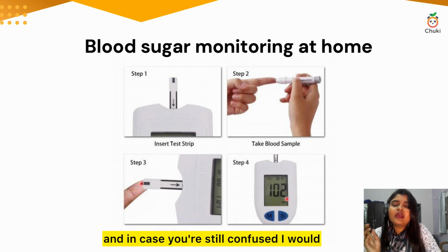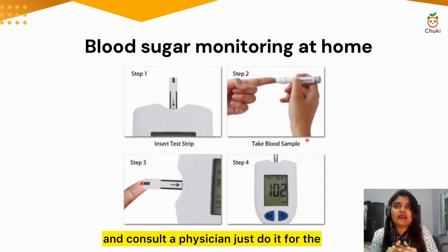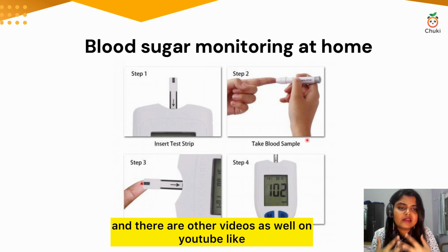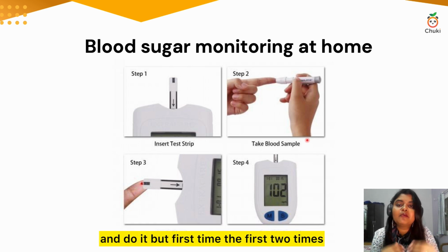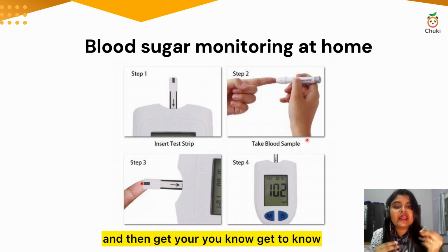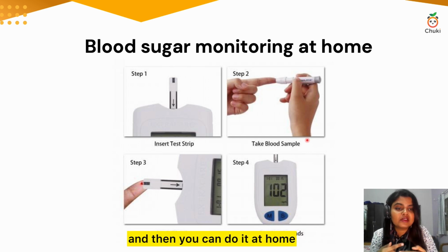And in case you're still confused, I would advise you to consult a physician. Just do it for the first time with them. There are other videos as well on YouTube, if you want to refer to them and do it. But for the first 2 times, I would say, please go to a physician and get to know how to use a glucometer, and then you can do it at home.